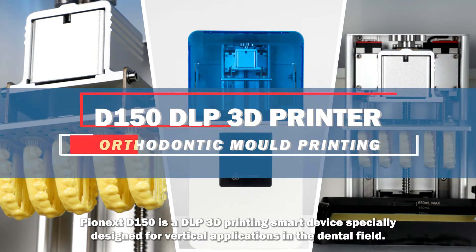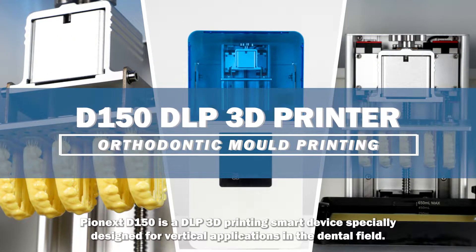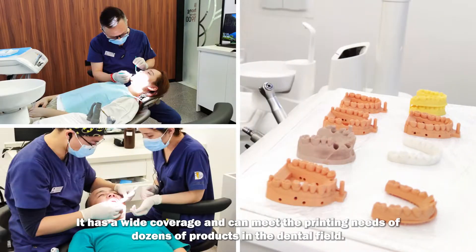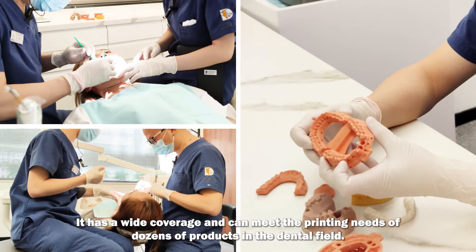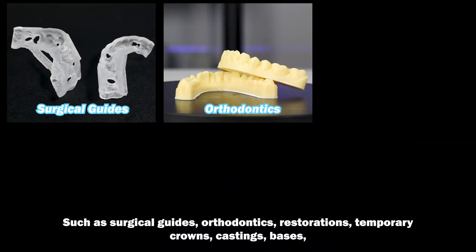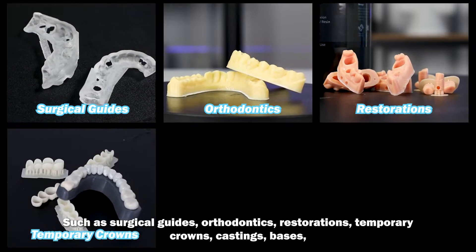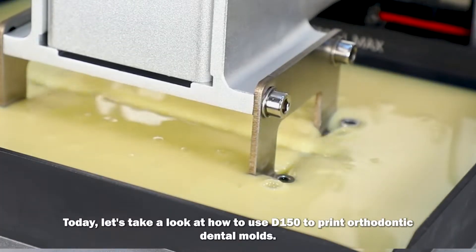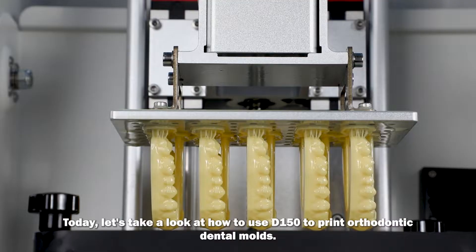Pionex D150 is a DLP 3D printing smart device specially designed for vertical applications in the dental field. It has a wide coverage and can meet the printing needs of dozens of products in the dental field, such as surgical guides, orthodontic, restorations, temporary crowns, castings, etc. Today, let's take a look at how to use D150 to print orthodontic dental molds.